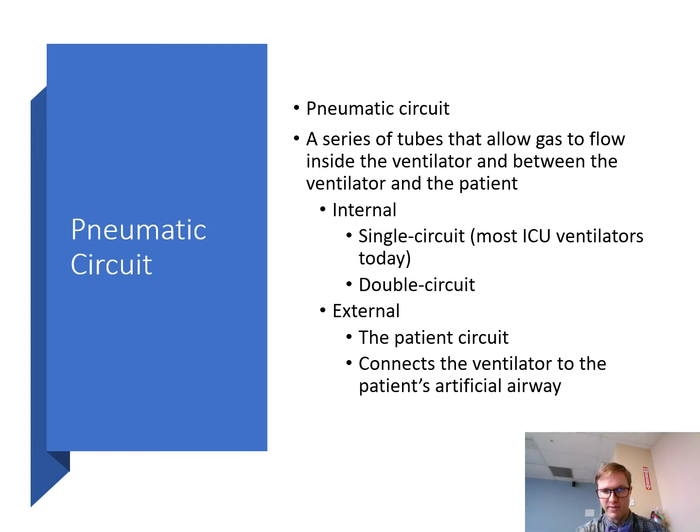That was a big mouthful, but let me talk about that again. Most modern ICU ventilators, and that's a big thing there, most commercially available intensive care ventilators are single circuit. So they have an internal compressor. They have microprocessor controls, so we can control different variables of how the breath is delivered, including oxygen concentration, volume, flow, and so on and so forth. And they're positive pressure, so they deliver higher mouth pressure compared to the alveolar pressure. And they have closed loop elements of logic.